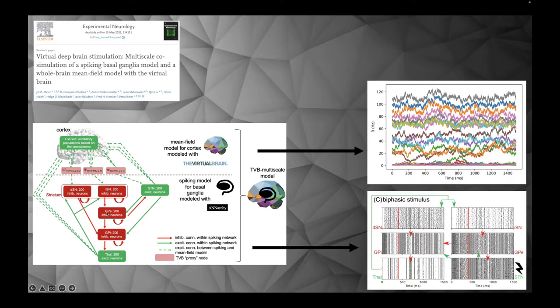And we have another question. How sensitive is this approach to the model parameters? That's a really good question. And at the moment, actually, we are trying to find that out even more. So we have lots of parameters here. If we look at this model, the parameters are optimized in this spiking network. If you look into the original paper where we took this optimized network from, they checked the literature and also the empirical fMRI data and set the parameters for that. So it's really optimized in the sense that it will give out a realistic fMRI signal, even fitting with the individual patient.